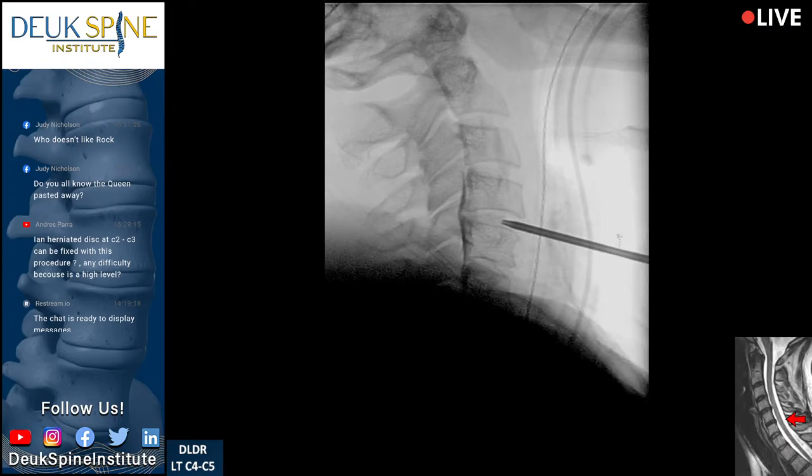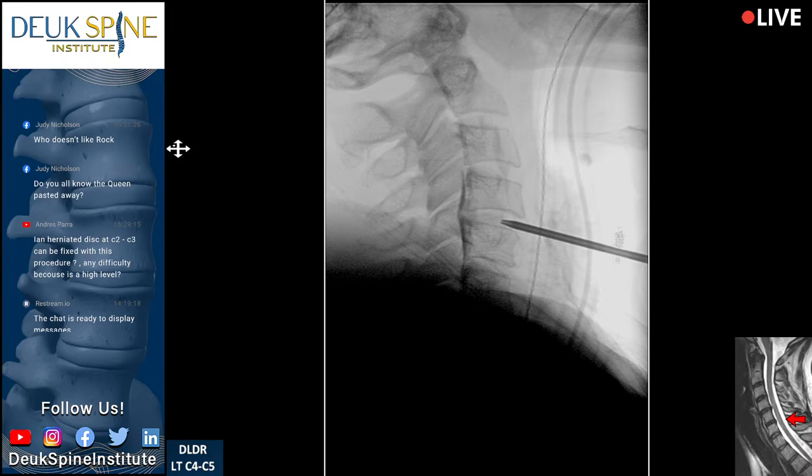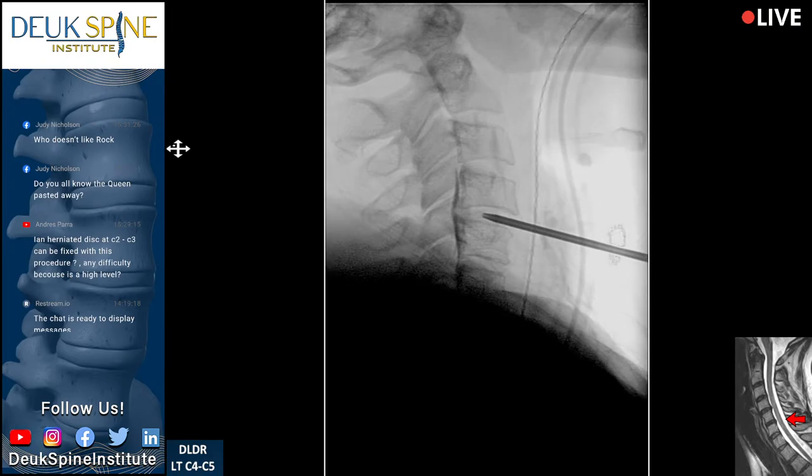We have a couple of questions. We're happy to take your questions while we're advancing this dilator in the disc to the back where the tear is.